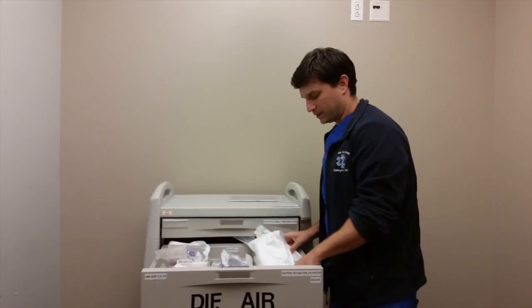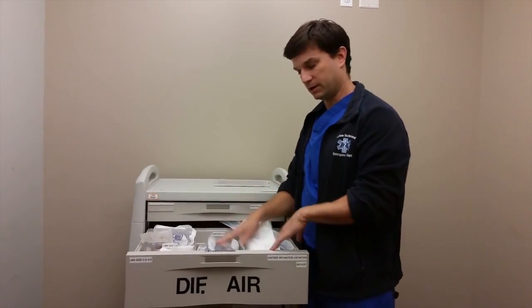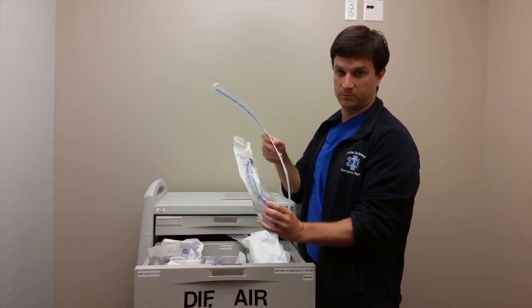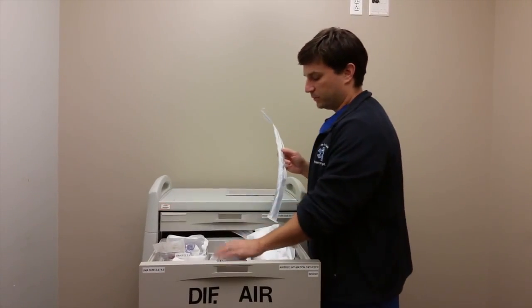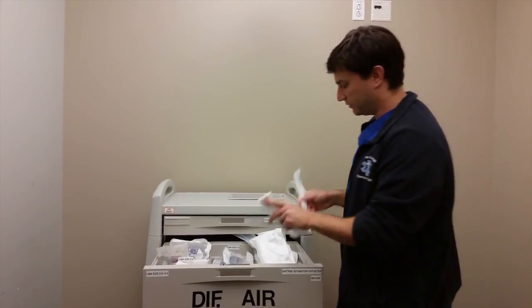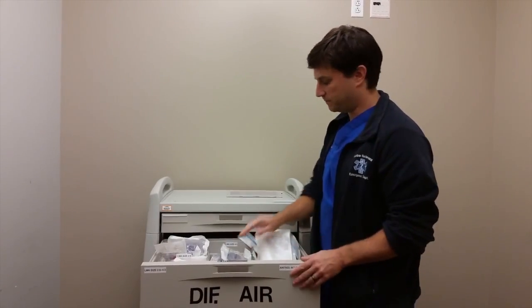But in order to do that, usually you've already had to ventilate them a little bit. So if you can't bag mask ventilate, grab the LMA first. You can pass the bougie through the LMA, right, blindly, or you can use the bronchoscope. So you have a lot of options and time once the LMA is in, not necessarily needed if you can bag mask ventilate the person safely. It's just more of a cannot ventilate, cannot intubate situation.